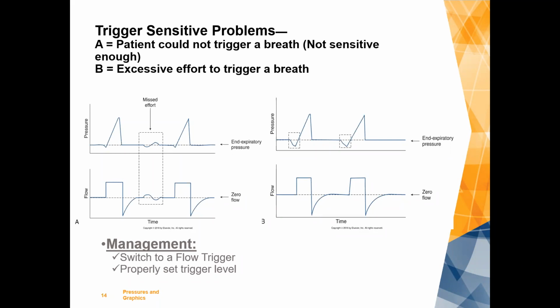I will tell you this, that pretty much 25, 30 years ago, the infant ventilators were becoming flow triggered almost universally. And it was recognized that a flow trigger imposes less work of breathing on a patient. And then a few of the vent companies and a few of the academicians that work with mechanical ventilation said, well, if it's good for infants, why not adults and older pediatric patients? So pretty much you'll find that, whereas 30 years ago, a lot of the adults were being set up on a pressure trigger of, let's say, -1, 1.5, sometimes even -2 centimeters.